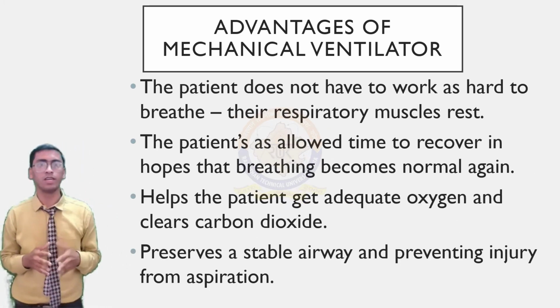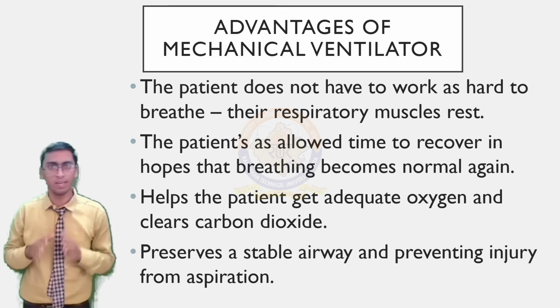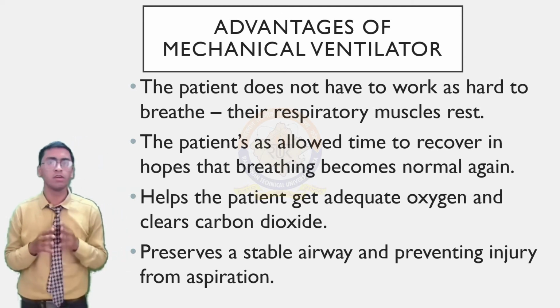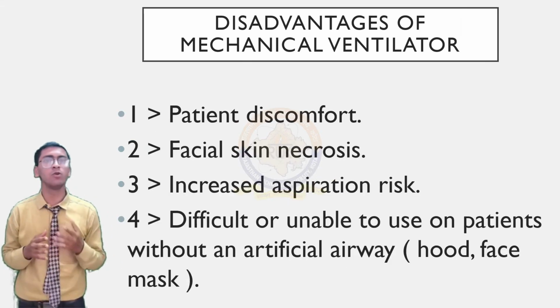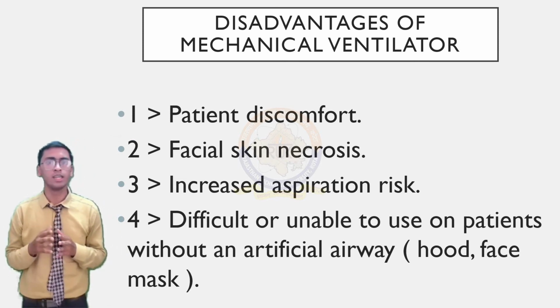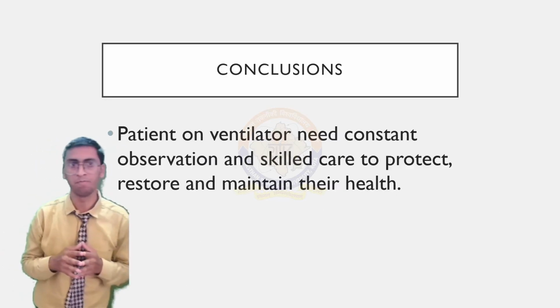Now moving to advantages of mechanical ventilator. The patient does not have to work as hard to breathe. Their respiratory muscles rest, it helps the patients get adequate oxygen and clear carbon dioxide, preserves a stable airway and prevents injury from aspiration. Moving to disadvantages of mechanical ventilator. Patients feel discomfort, facial skin necrosis, increased aspiration risk, and it is difficult to use on patients without an artificial airway.